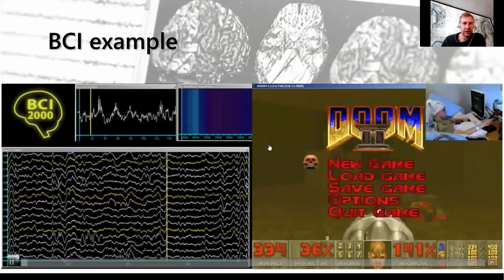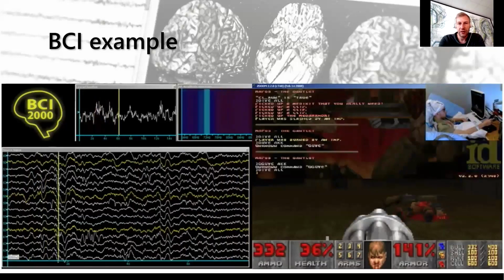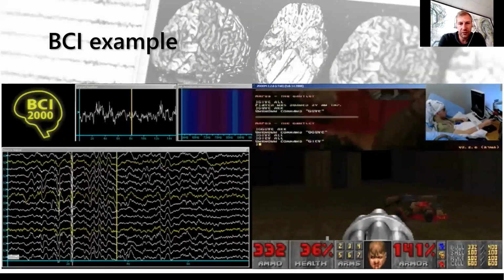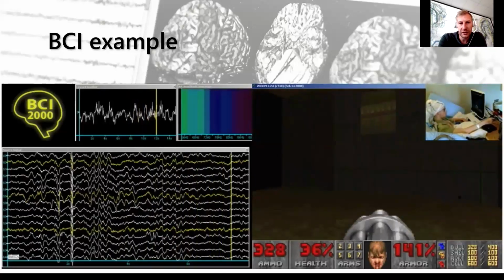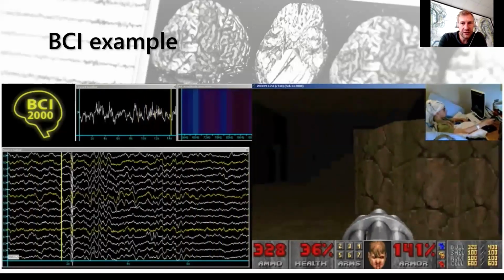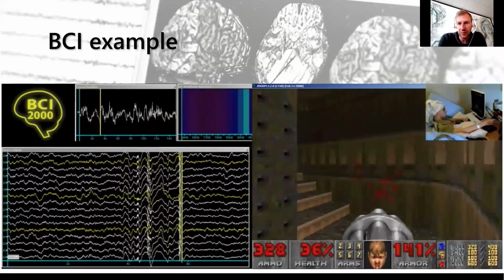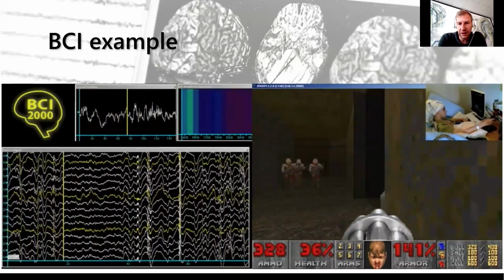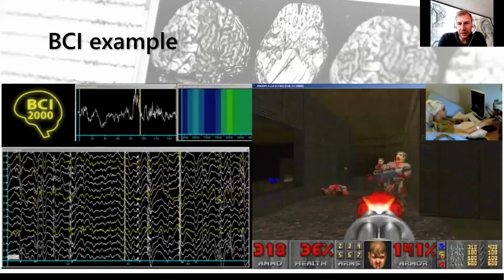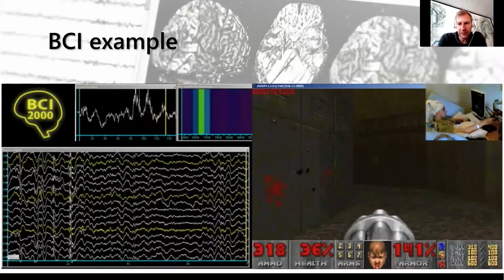And yeah, when we take the features from the oral motor cortex, we can also now look at an example from a brain-computer interface that was established by Gerwin Schalk in BCI2000. So here the subject is now playing Doom, the video game, with a joystick with the hands directly, but the shooting is solely triggered by the oral motor cortex.